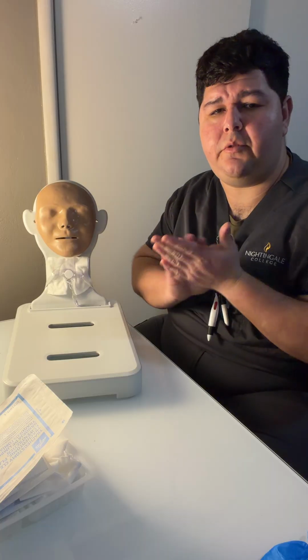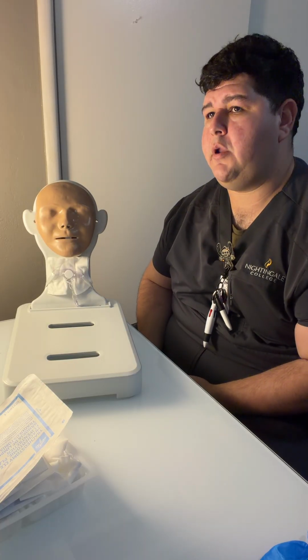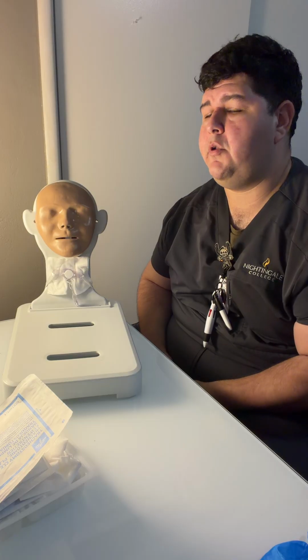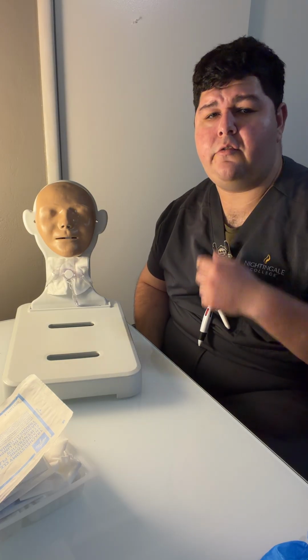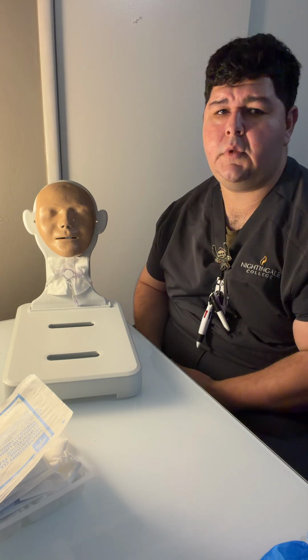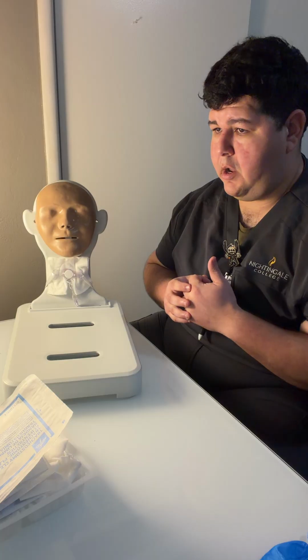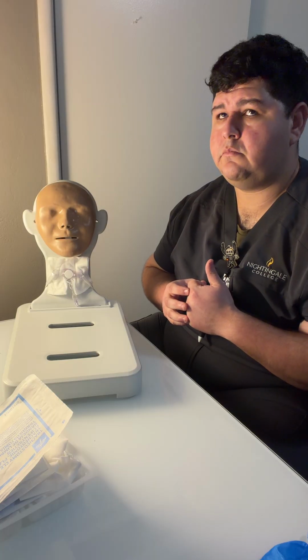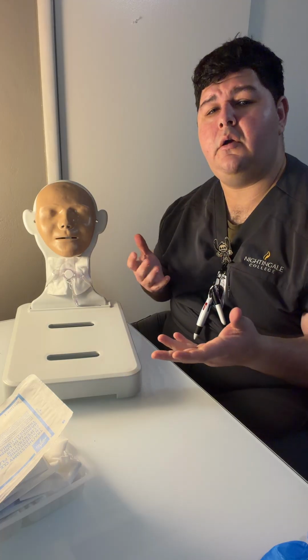I introduce myself to the patient. Hello, sir. My name is Jose. I'm one of the nurses here. Can I have you please state your name, your date of birth, and the medical record number if you know it? Perfect, and we'll verify that with the wristband, as that is 2 patient identifiers. Okay, Mr. Miranda, today we're going to be doing some tracheostomy care. Is that okay? Okay, all right, so we're going to go ahead and get started.